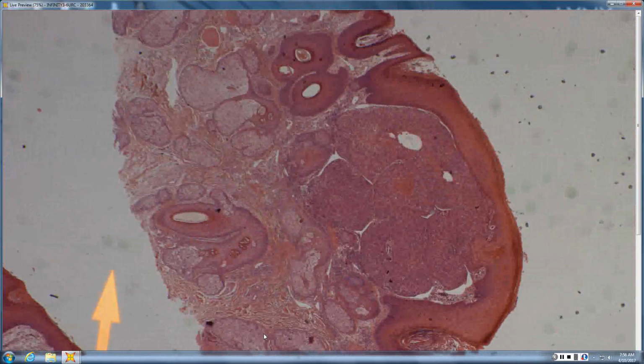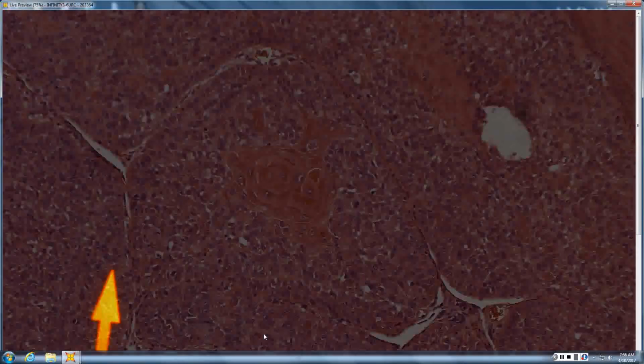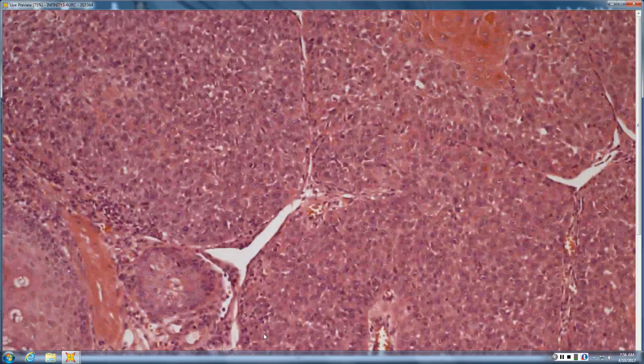I was kind of worried about a squame. It certainly looks like it. Those are ugly cells, with a high nuclear-cytoplasmic ratio coming off the epidermis. It doesn't palisade, so I would say squame. All kinds of writing on here. What do they say? Squame is what it amounts to.